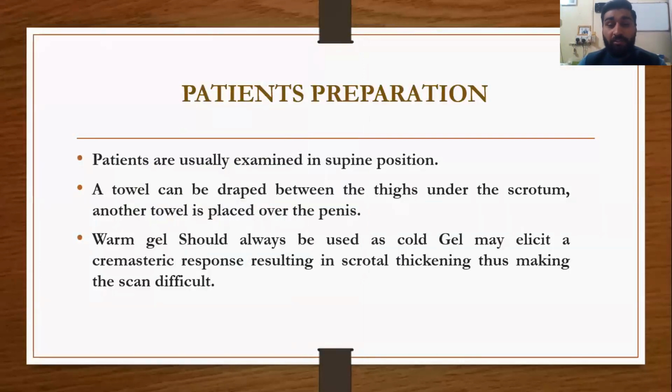Warm gel should always be used as cold gel may elicit a cremasteric response resulting in scrotal thickening, thus making the scan difficult. The same thing, we should use the warm gel rather than a cold gel because it thickens the cremasteric muscle.